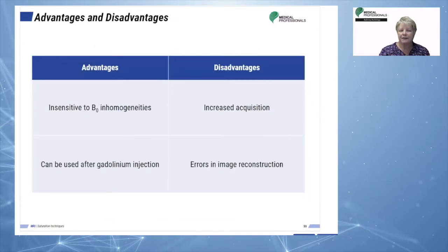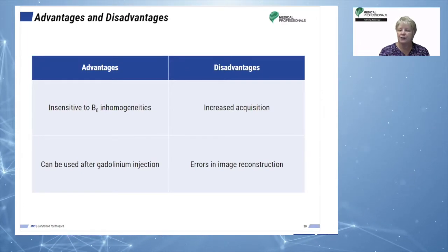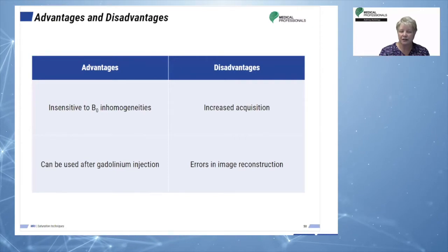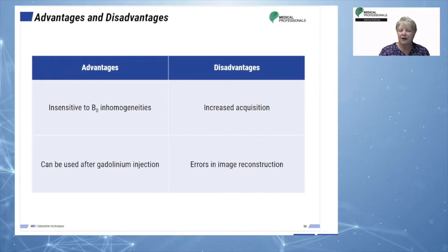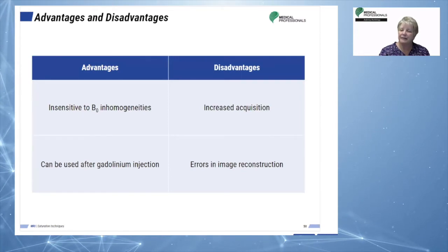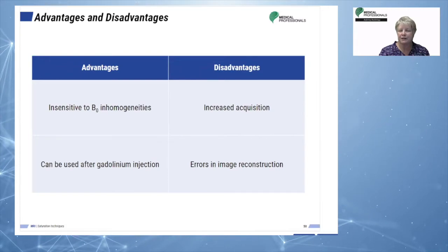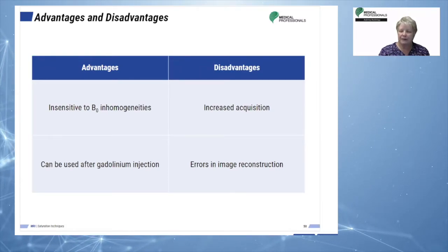The advantages of this technique are its insensitivity to inhomogeneities and its usefulness after the injection of contrast media. The primary disadvantages are an increase in acquisition time, as a longer TE is necessary for the addition of contrast acquisitions. I want to go back to what I said on the previous slide.